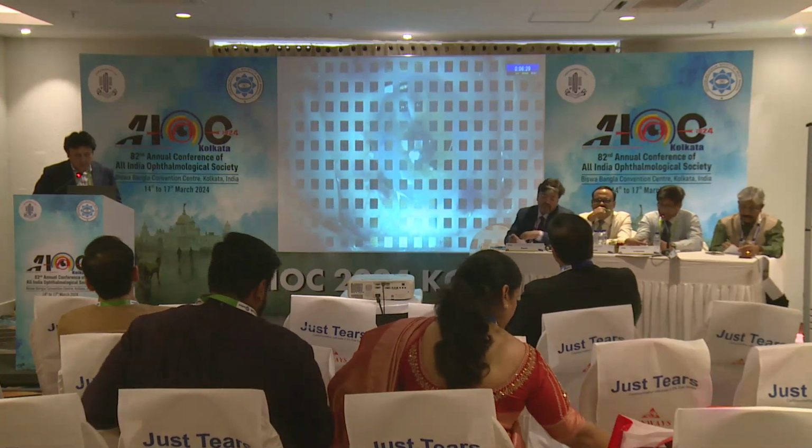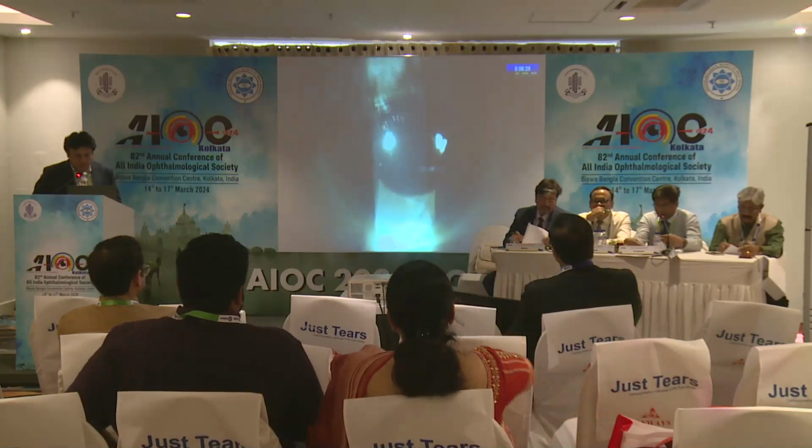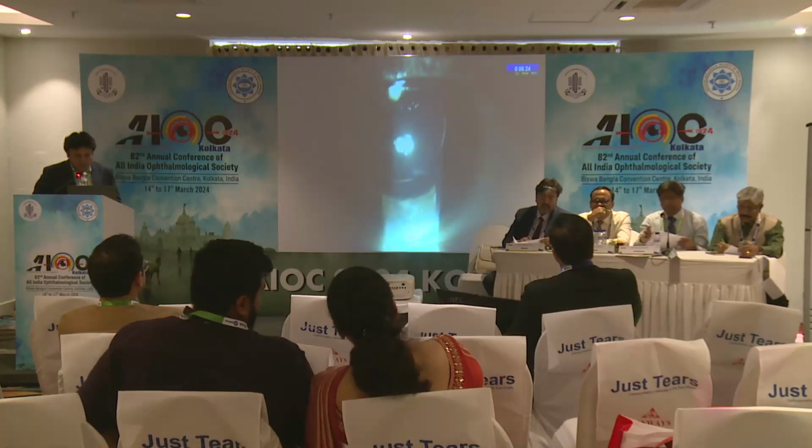So this is the final picture of a well-centered lens. Slit lamp examination reveals a quiet eye and a stable lens. And the flanges can also be appreciated resting intrasclerally.